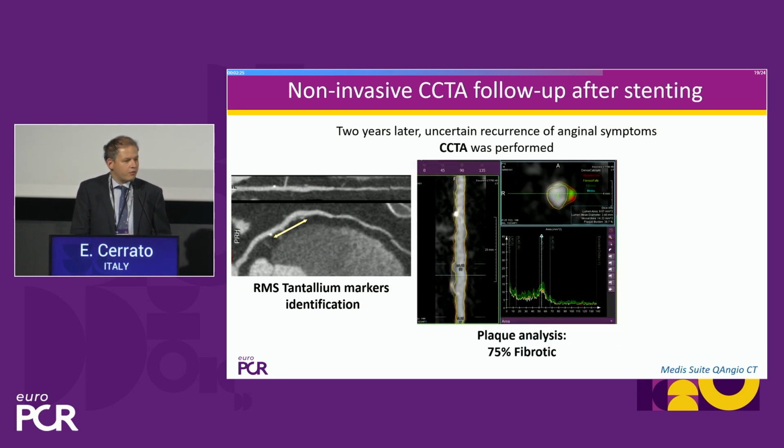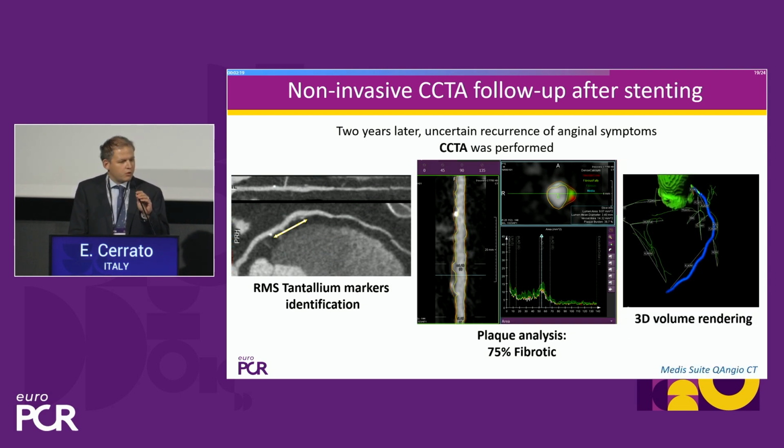We can have information about plaque analysis. In that case, it was 75% fibrotic, and we can also have 3D volume reconstruction of the vessel.